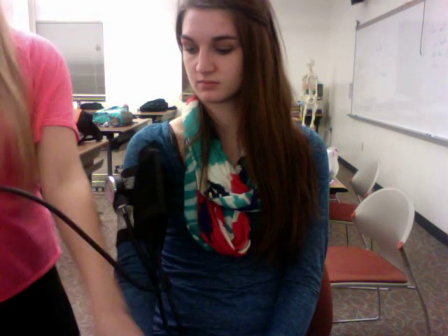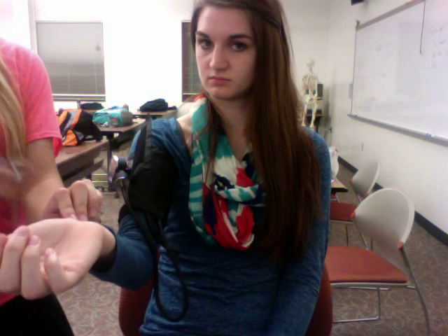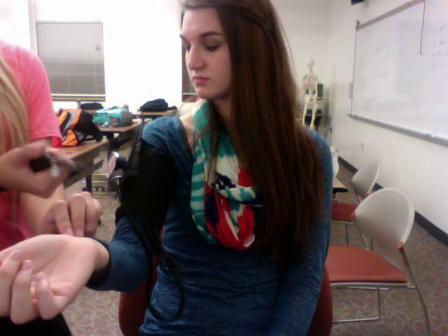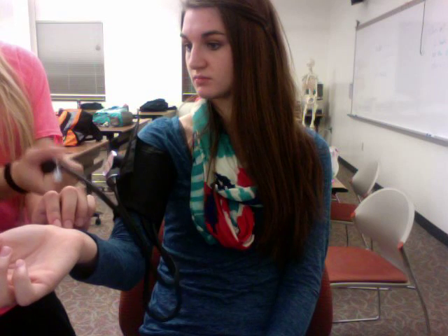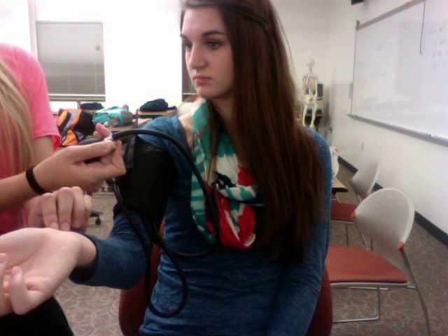You would then locate the radial pulse, which is located on the lateral side of the wrist below the thumb. Next, you will pump the cuff to approximately 180. You will then release the valve slowly to deflate the blood pressure cuff, and you will feel for a pulse to start again.